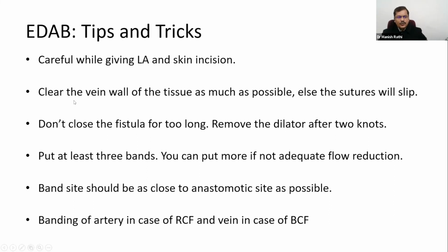This I have said earlier: you should try to clean the vein wall of tissue as much as possible. Otherwise, if you are not cleaning it up, the sutures will come together and your three bands will become one band, which you don't want. You want a good reduction, because otherwise at one segment there will be a tight stenosis and another segment will be dilated. You don't want that. To avoid that, clean your vein wall of tissue as much as possible.